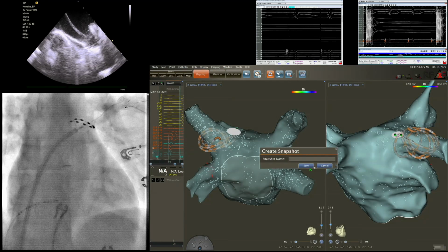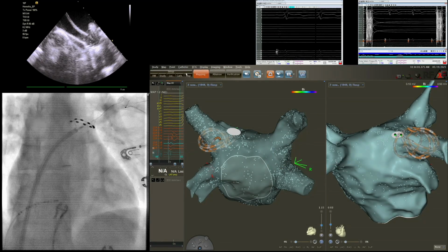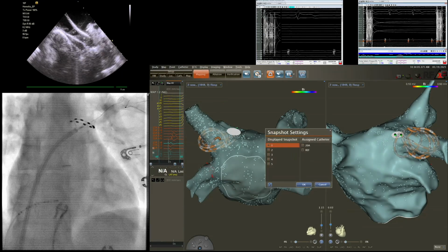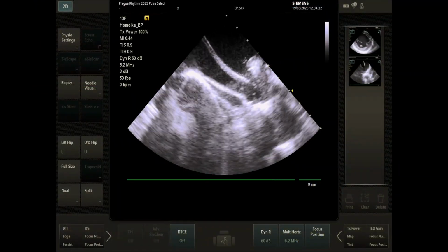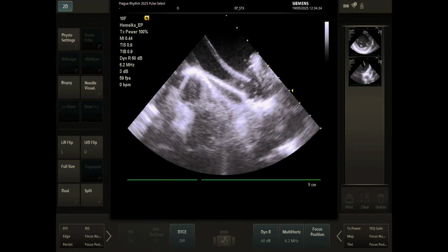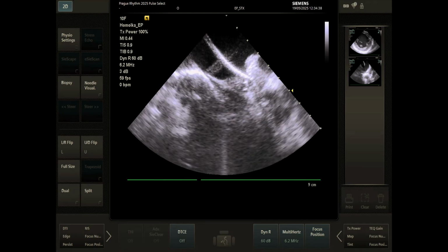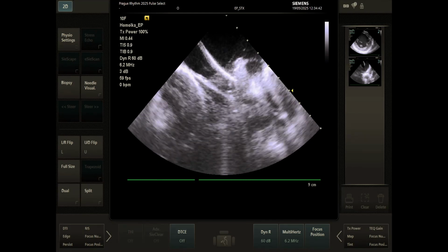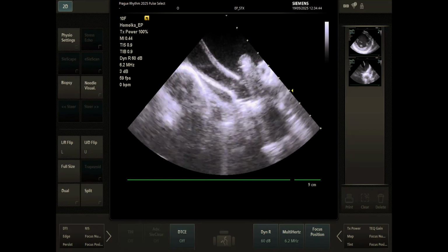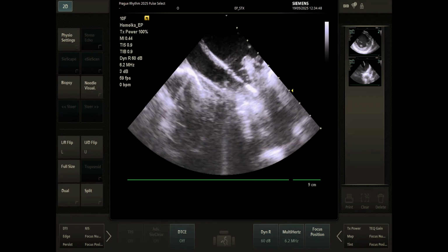And just maybe one thing. Sorry. Please, one thing with this ICE view, we are in the left atrium, but I just flipped the ICE probe like a supramitral view to look at the superior vein right here. You see the appendage and reach the same view here. Yes. So we are just sitting on the ridge, almost on the edge of the ridge here. This is the ridge appendage. Yes. It's very nice.